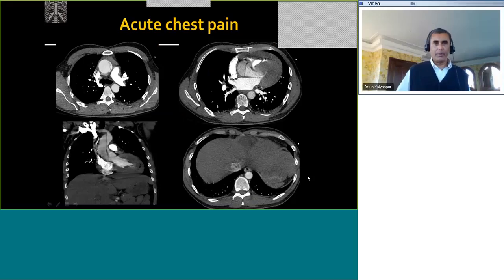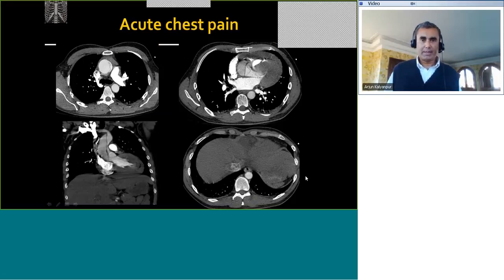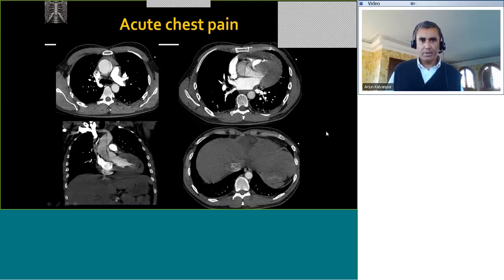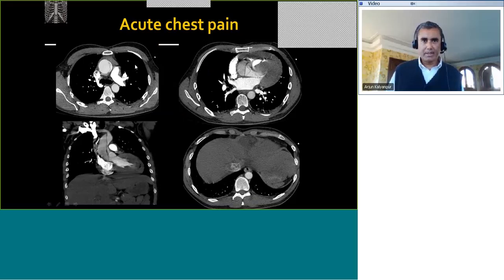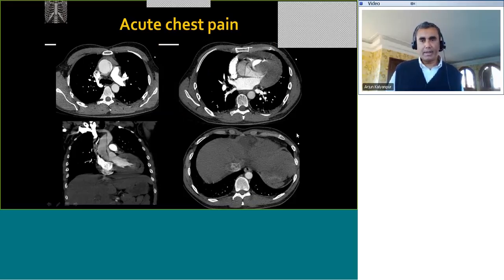Another important skill in emergency radiology is to put together patterns and look for complications. In this case, patients come in with acute chest pain. The finding is again in the aorta — we have a dilated aorta with an intimal flap in the ascending aorta. On these reformats you can see it more clearly. This is in fact an ascending aortic dissection, or Stanford type A dissection. We could stop there, but there is more to look for.